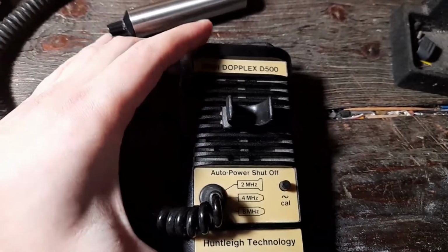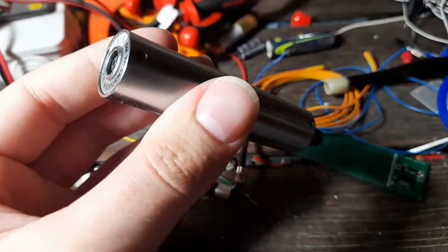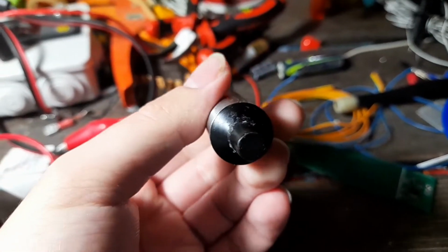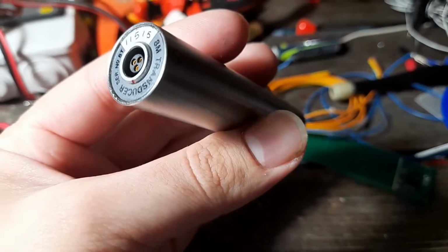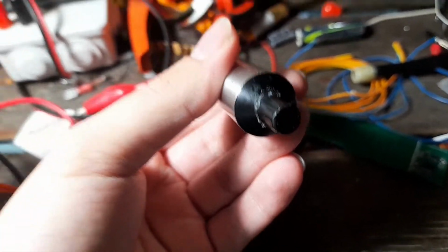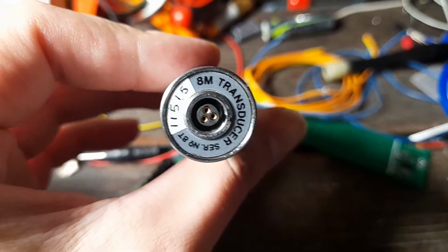This is a medical device that is used by doctors to evaluate the body's circulatory system. It consists of this transducer, which uses ultrasound, specifically a transmit and receive crystal, and it measures the Doppler shift between the transmit signal and the received signal, which results from the blood flow. This one specifically is at 8 MHz.